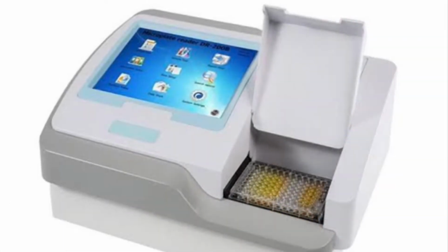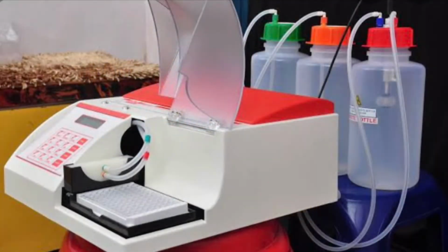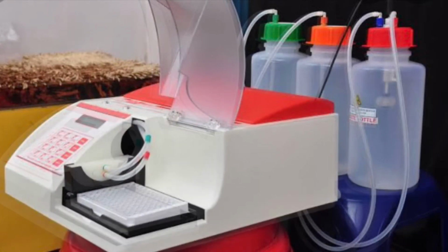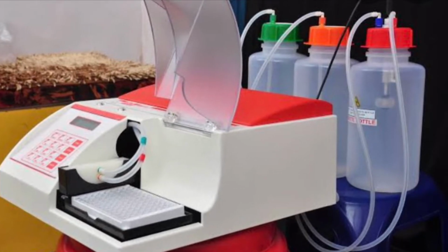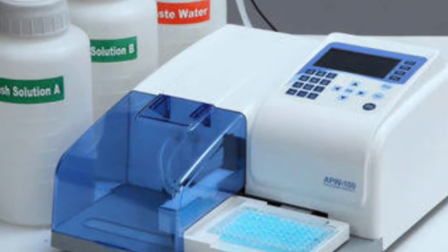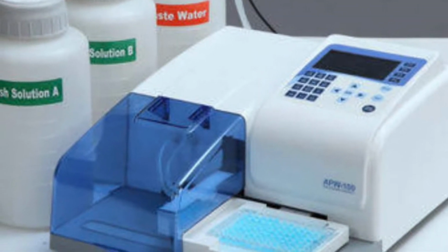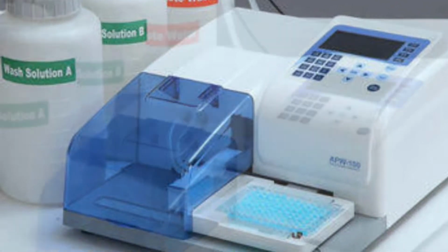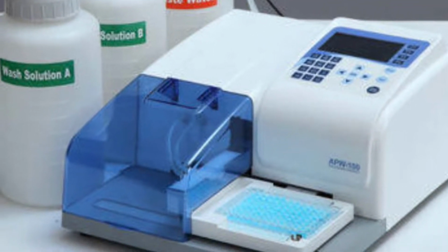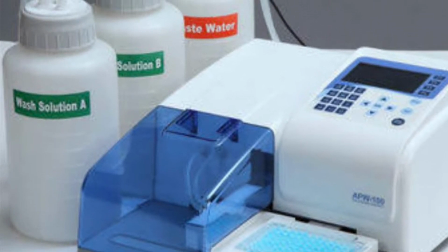For example, when a patient comes to the hospital with symptoms related to dengue and the physician asks to go for the test, if you perform the rapid test, generally it gives a positive result only if that is positive, but sometimes it may give a false negative. In that case we have to go for the confirmatory test, which is ELISA. So for confirmation of results only we have to perform the ELISA, not as an everyday test.